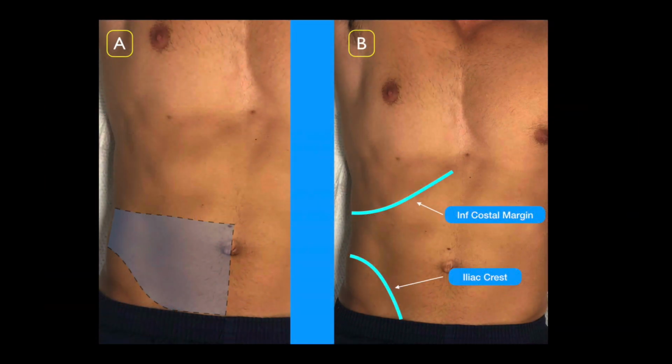So just to go over the anatomy for the TAP block, and this is the lateral TAP. Really, it's a space between the inferior part of your costal margin and the superior part of your iliac crest. You can see it can get all the way down here. We've done them before for gallbladder issues as well, which will get a little bit higher. But this is the basic idea, and it's surprising to think that we only have this little bit of space in between that.